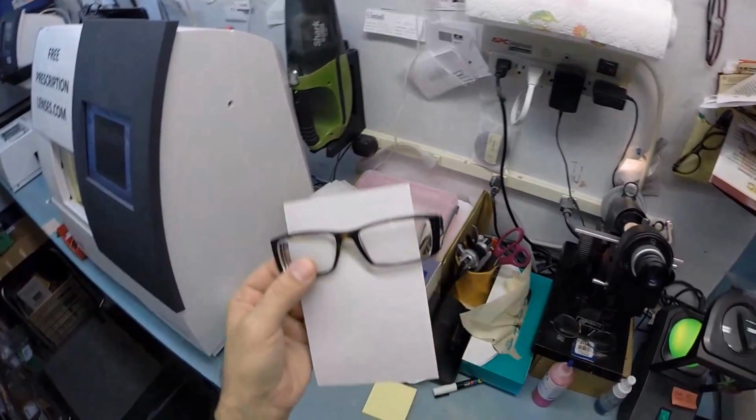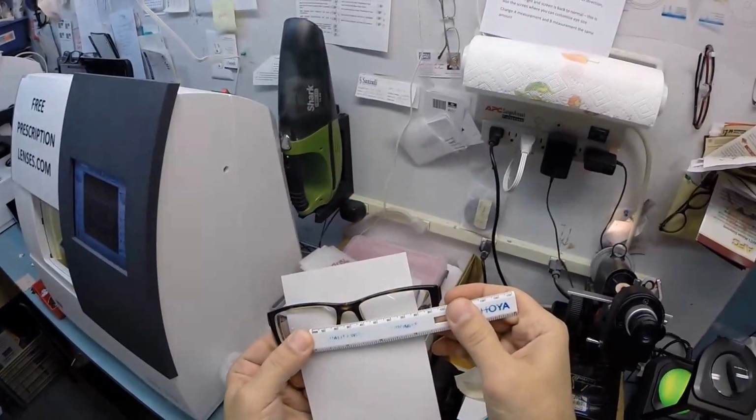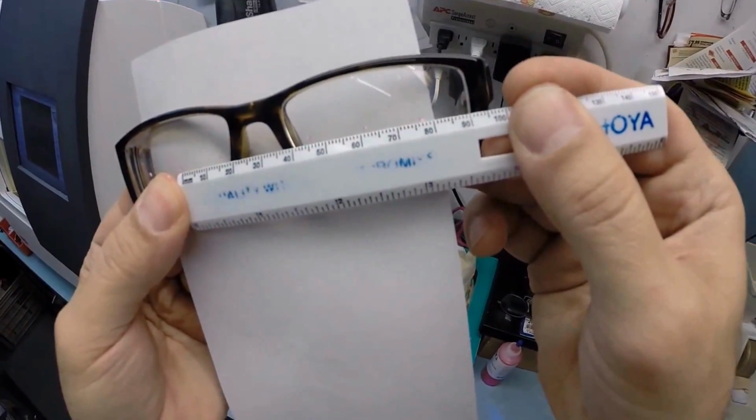I'm going to turn the card around, and when I put my thumb on the right lens at 0 and I measure at the left lens, we have 61.5, so that is made correctly.